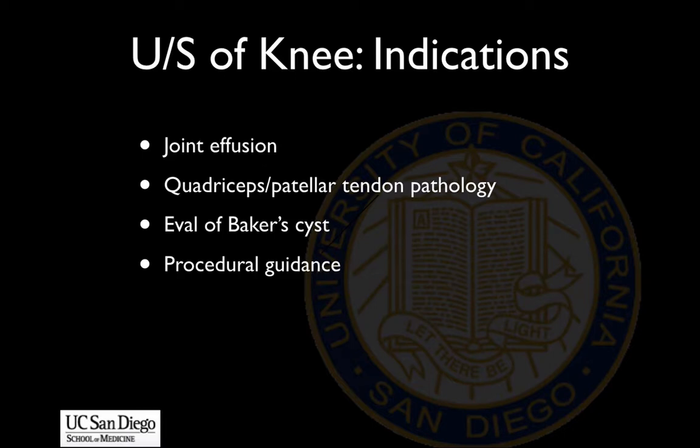You may ask, why would we want to perform a knee exam with ultrasound? There are many reasons. The list here is by no means comprehensive, but is just an overall look at some of the reasons you might want to perform ultrasound of this particular joint. One that easily comes to mind is the assessment of joint effusions. In addition, as you're about to see in a few of the slides ahead, we can get excellent visualization of both the quadriceps and the patellar tendon, and so pathology in these areas can be quite easily discerned with ultrasound exams.